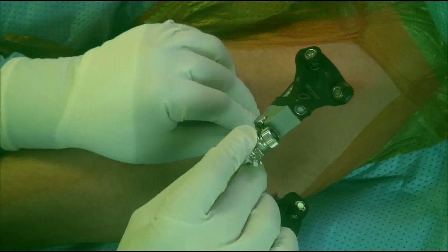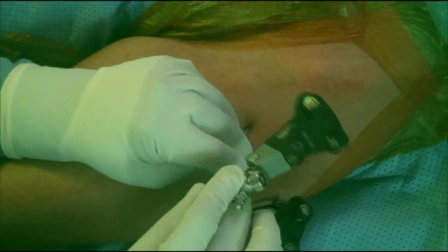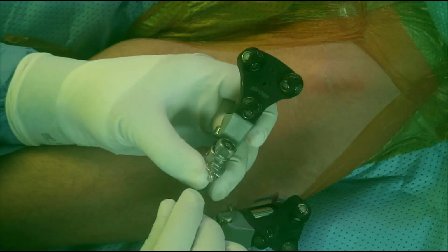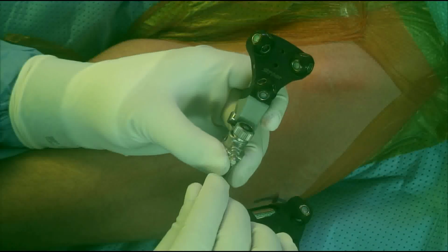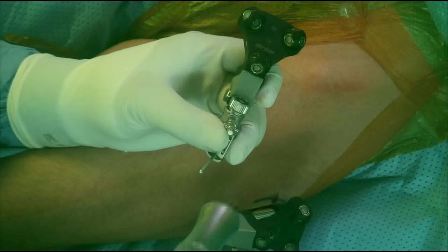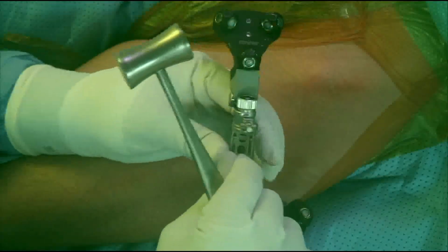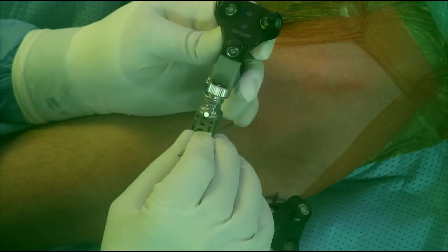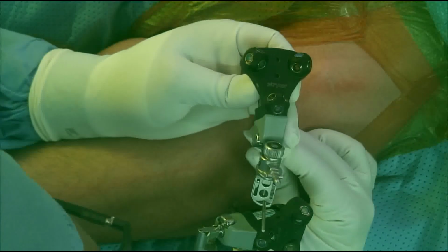One drawback of this technique is that, because the K-wire is attached snugly to the tracking device, we cannot use the drill, and we have to use a hammer to hammer the tip of the wire into the bone. Again, this is not complicated, it's simple and straightforward, and the guide wire can easily go through the bone by the hammering process. But we are working as well on a jig that allows the drill to be used.